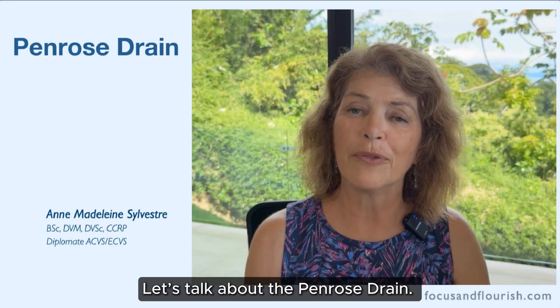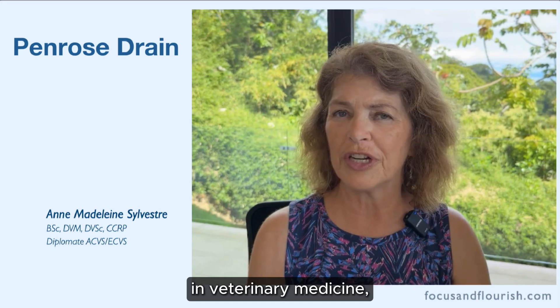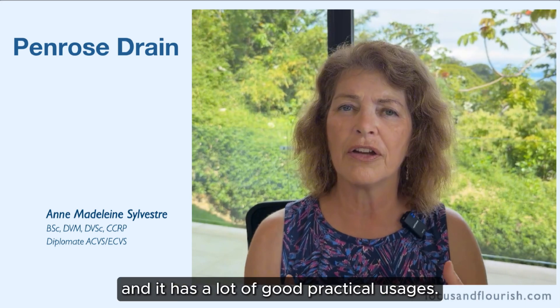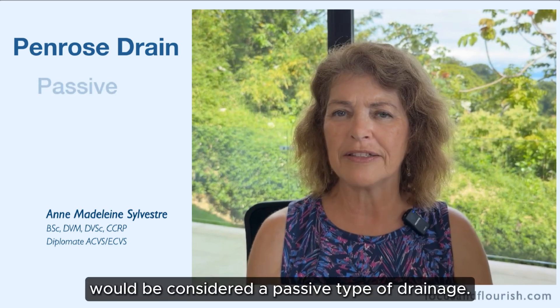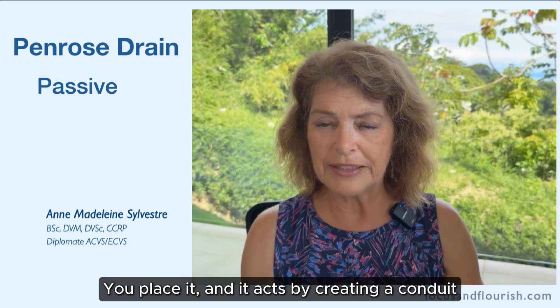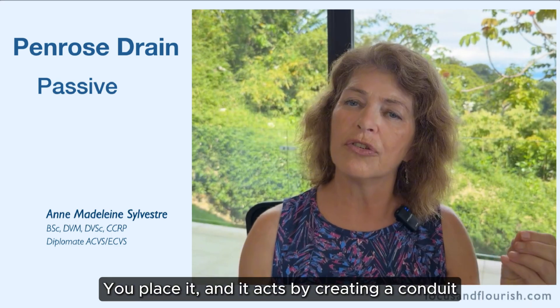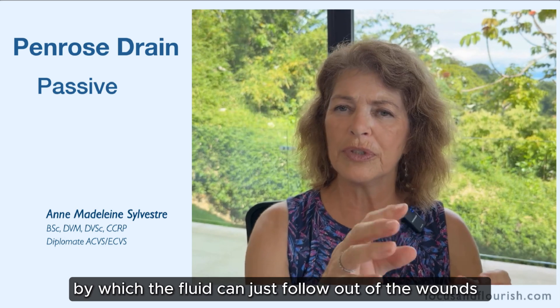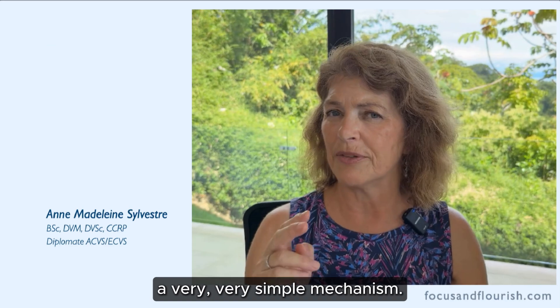Let's talk about the Penrose drain. It is such a commonly used drain in veterinary medicine and it has a lot of good practical usages. The Penrose drain would be considered a passive type of drainage. You place it and it acts by creating a conduit by which the fluid can just follow out of the wounds. Very simple mechanism.